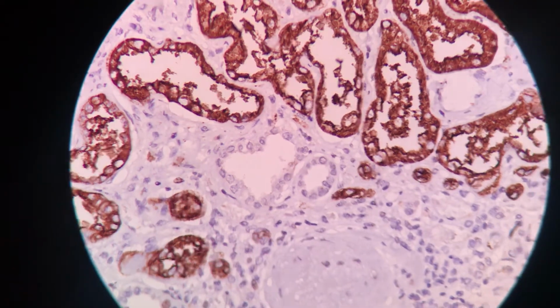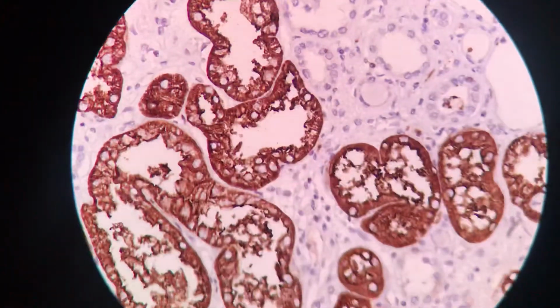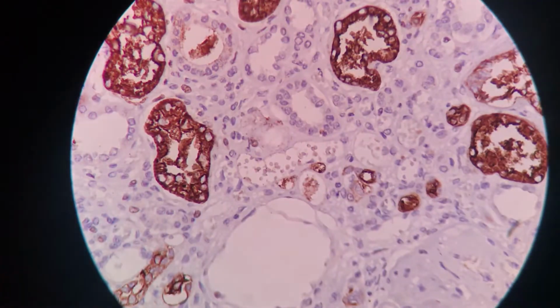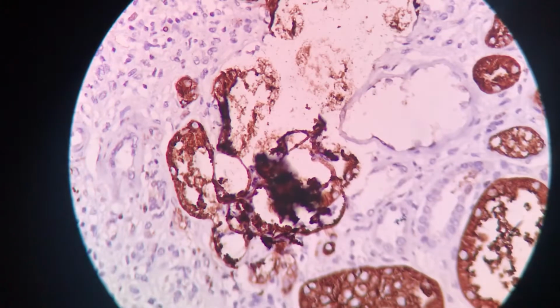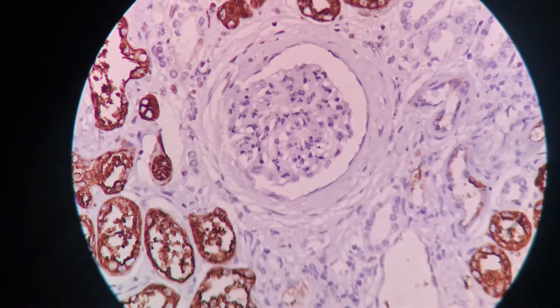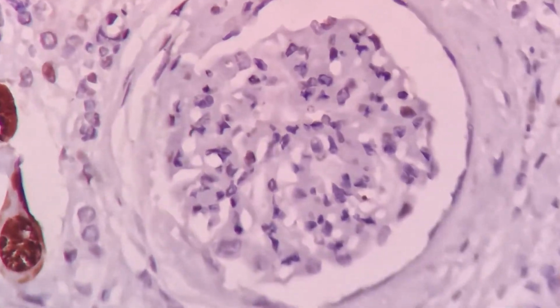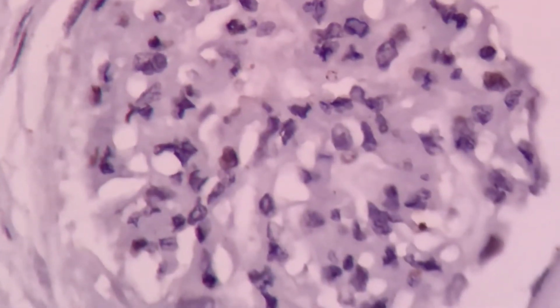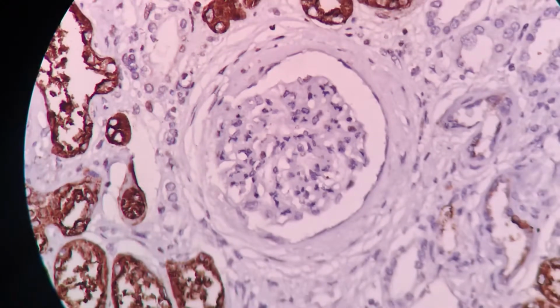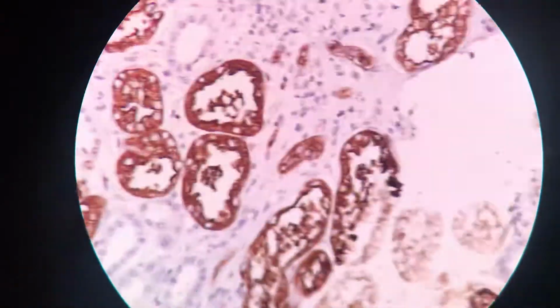If you focus on the glomerular structures, you can appreciate that there is no staining. If at all one finds staining, that would be of occasional entrapped granulocytes. Granulocytes are CD15 positive cells, so they should get stained.